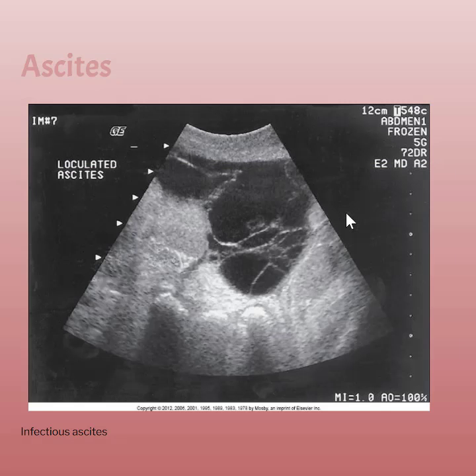And here's another example of exudative ascites. This time we are seeing loculations through the ascites. This quite often represents adhesions where the body has been trying to wall off infections, and we end up seeing these loculated pieces floating in the ascites.